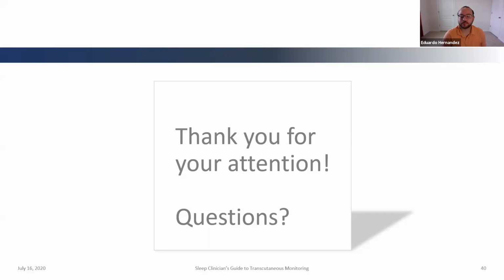We try to account for that within some algorithms within the monitor, but usually there is just a little bit of difference, and we do read a little bit higher. That was for Gus. You had put that question up there.